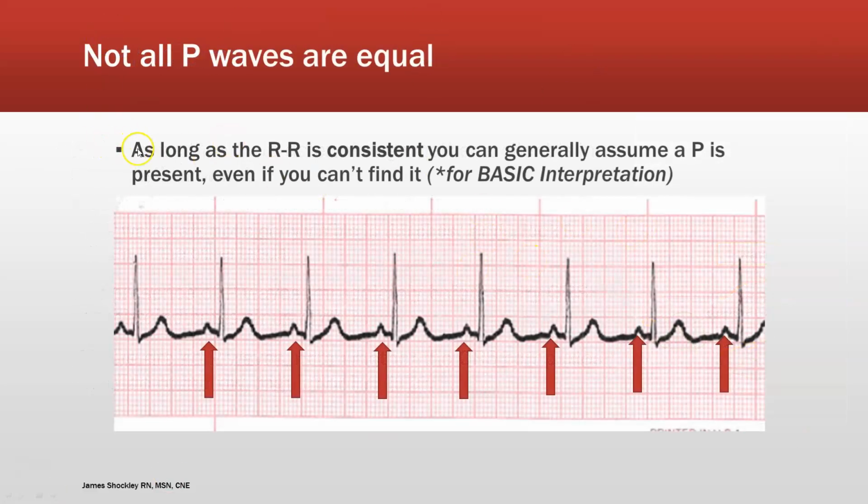As we are looking, again, we're going to count the atrial rate with the ventricular rate. We want to make sure that we're counting our 6-second strip. Again, that's something that I would give my students. If I gave them this rhythm, I would say in my question, the nurse is reviewing the client's telemetry. This is a 6-second strip. So we do see that we have consistency.